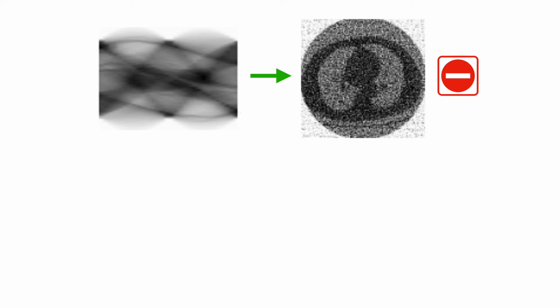We can now use this network to produce better reconstruction images. Let's look at the following new input, again a sinogram taken of a patient. If we just reconstruct the image without making any further modifications to this measurement, we get the typical artifacts that we have already discovered.